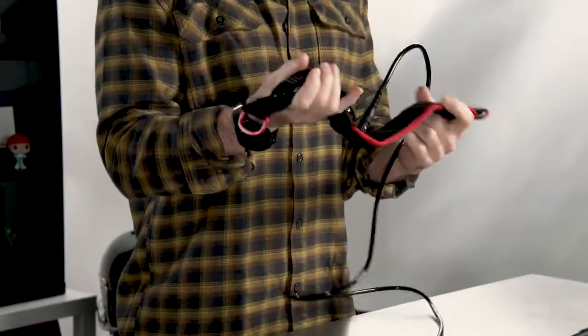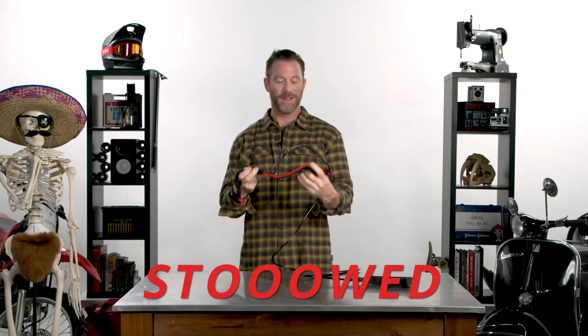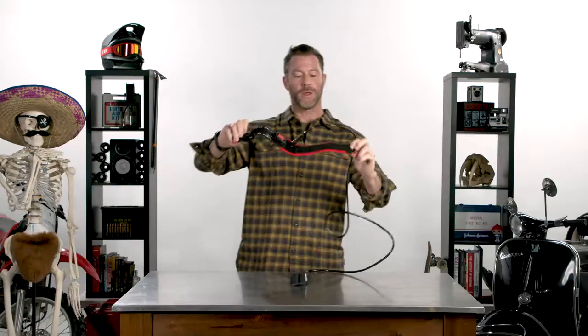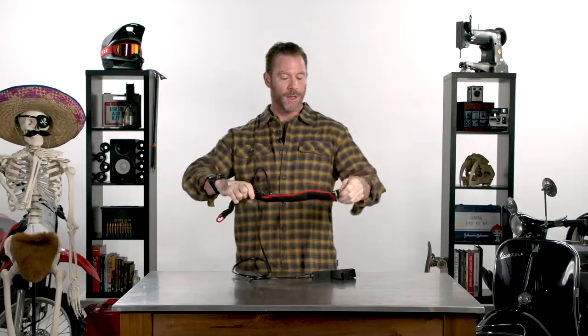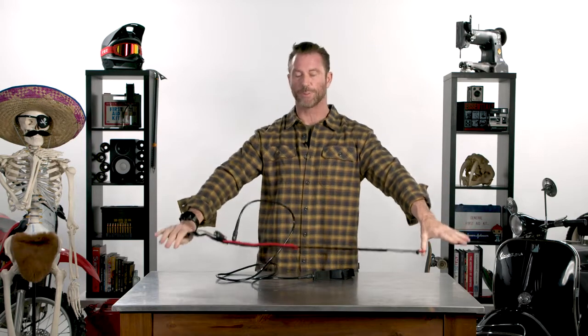The tourniquet itself is 19 inches when it's stowed. It's 2.5 inches wide on this part of the band, 2 inches wide on the ratcheting part. When you extend it out all the way, it goes out to 38 inches, so there's plenty of room to get around a lower extremity.